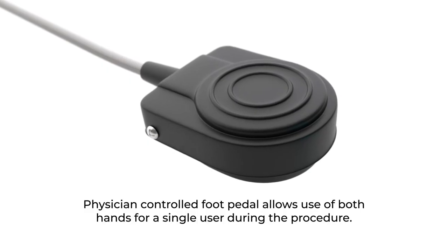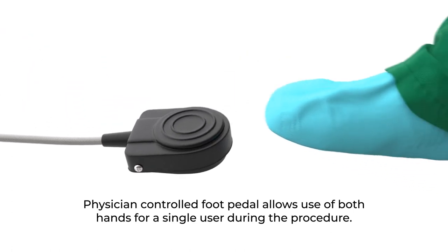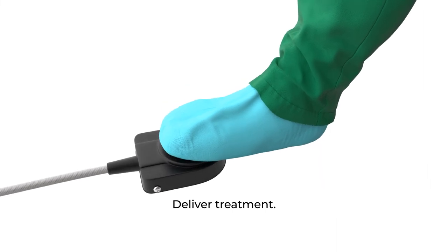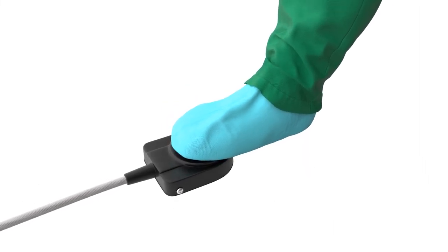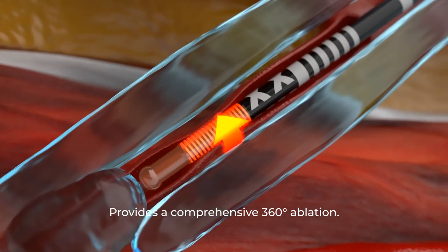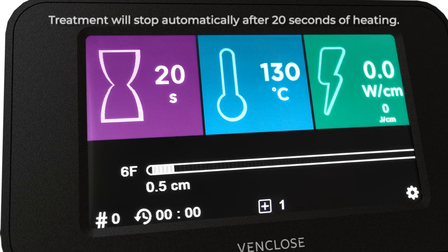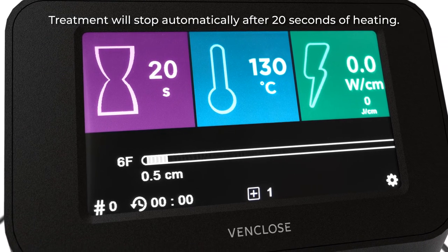A hands-free physician-controlled foot pedal is provided to start and stop treatment without the need for additional staff assistance. Begin an RF treatment by pressing the button on the catheter handle or by stepping on the generator foot pedal. The VenCloseMaven catheter provides a comprehensive 360-degree ablation. A 20-second treatment cycle at a set temperature of 130 degrees Celsius begins.